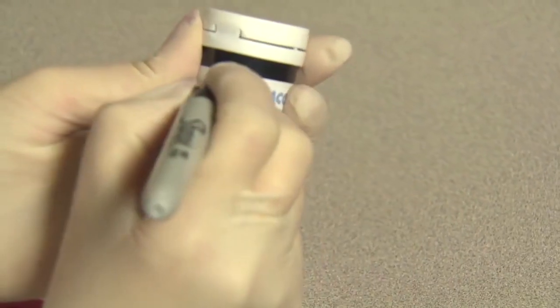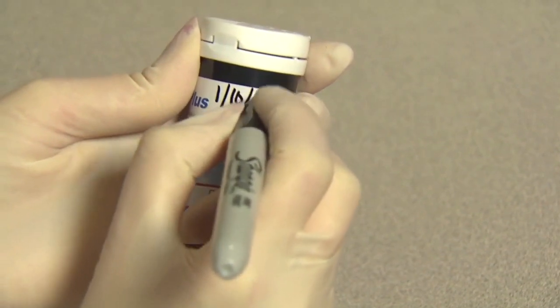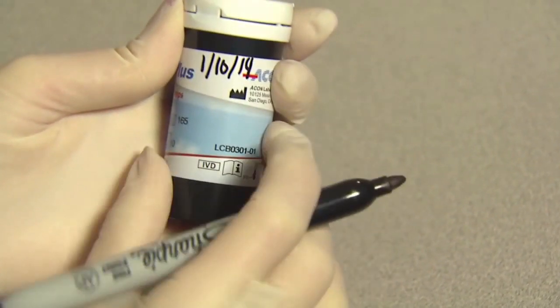Make sure you write down the date on the canister if opened for the first time. Discard the canister, test strips and test devices after 3 months from the date the canister was opened.